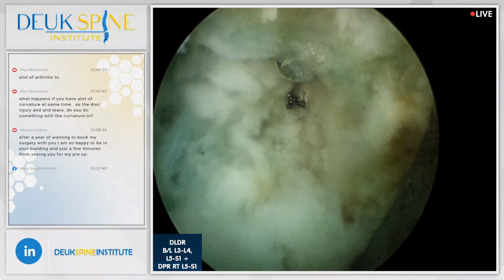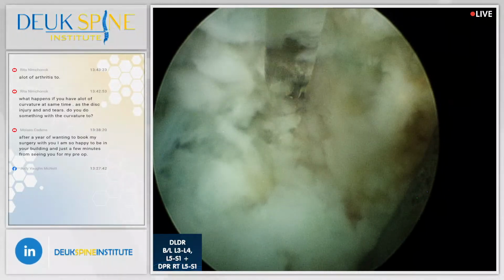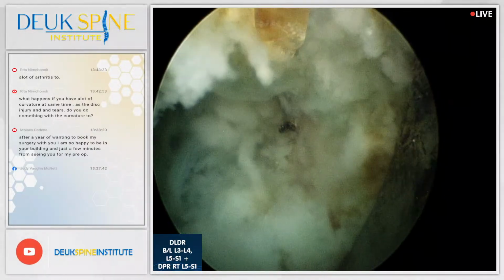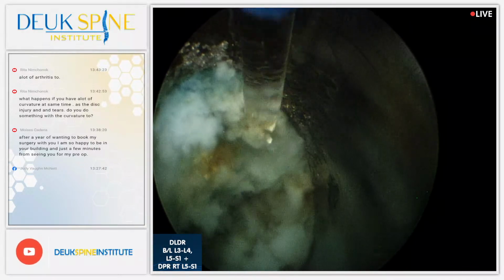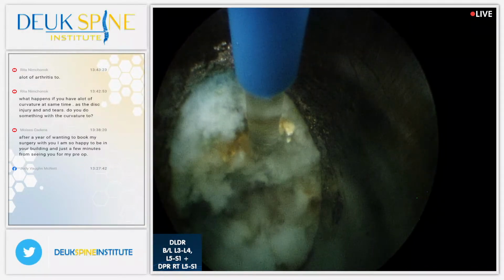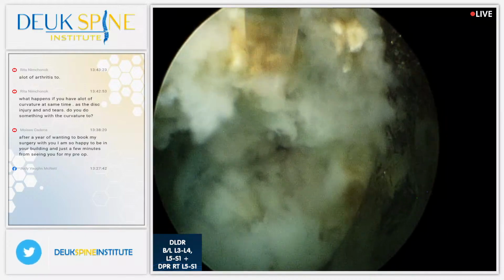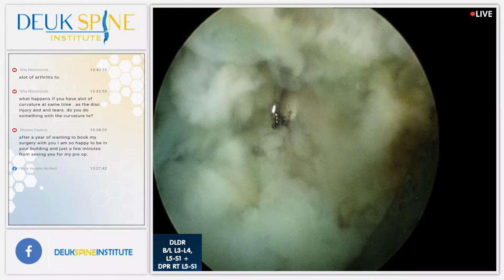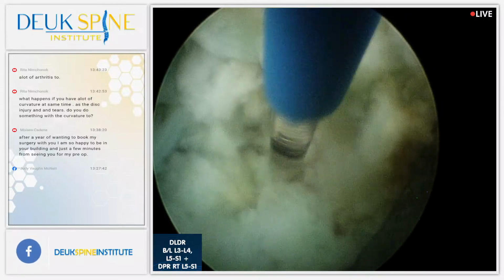that was the needle. You guys see it right there? Yes, we do. You see the laser fiber, and just behind it is the tip of the needle. That spark was the laser energy being delivered to the metal of the needle. And is it okay? Yeah. All right. So sometimes what happens is I'll hit the needle. Show us the needle, Luis. Push it in. Push it in a little more. All right, you guys see the needle right there? Yes, we do.